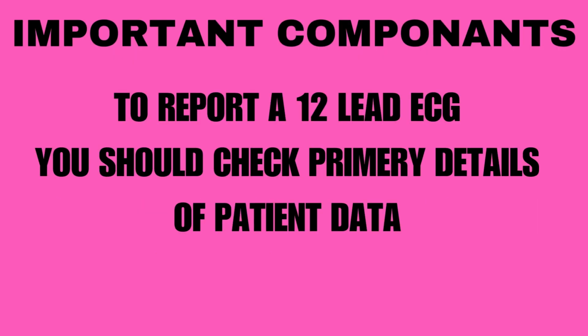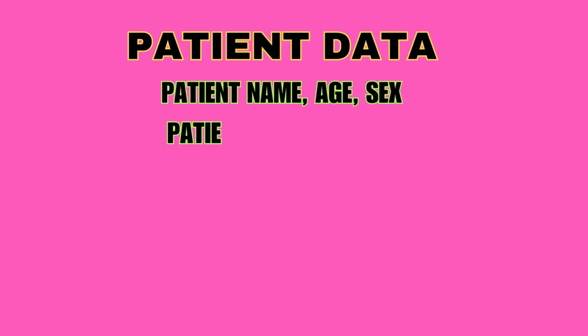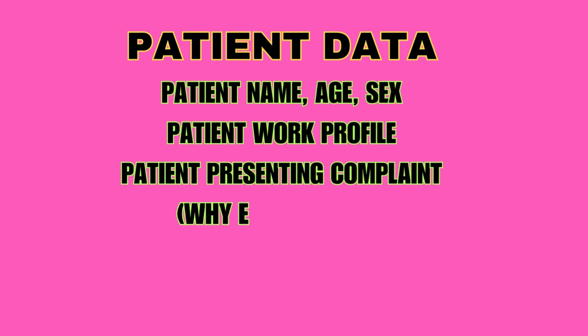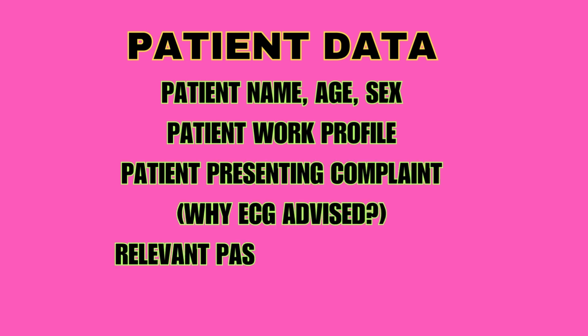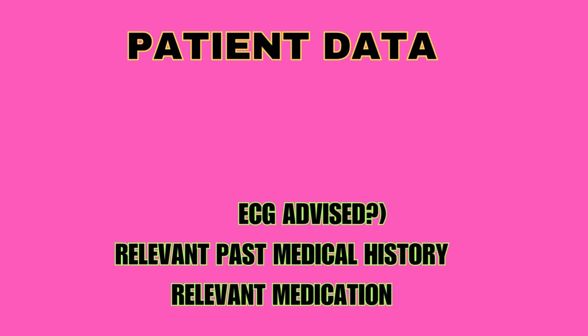Important components of ECG. Patient data. To report a 12-lead ECG, you should check primary details of patient data. Patient data includes patient name, age, sex. Patient work profile, patient presenting complaint. Why ECG advised? Relevant past medical history, relevant ongoing medication.